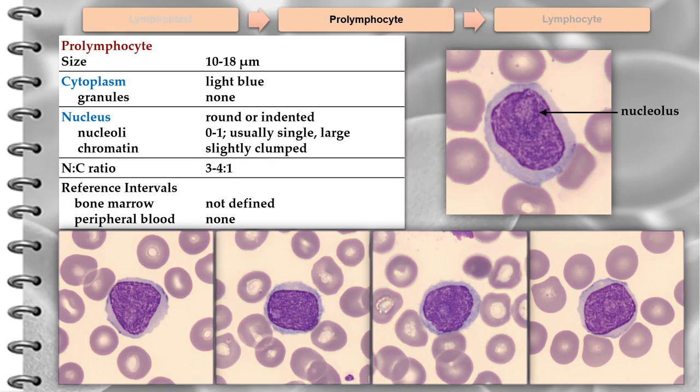The prolymphocyte varies in diameter from 10 to 18 micrometers, with a lower nucleus-to-cytoplasm ratio than the lymphoblast. The cytoplasm is light blue and non-granular, and is more abundant compared with the lymphoblast. The nucleus is round, oval, or indented. The chromatin is slightly clumped, intermediate between the lymphoblast and mature lymphocyte. Usually one large prominent nucleolus is present.